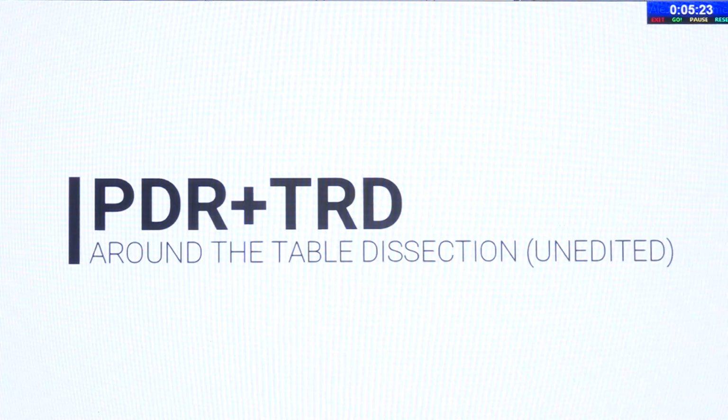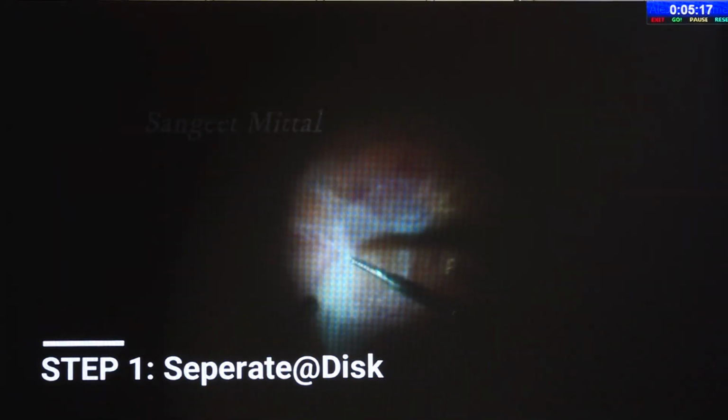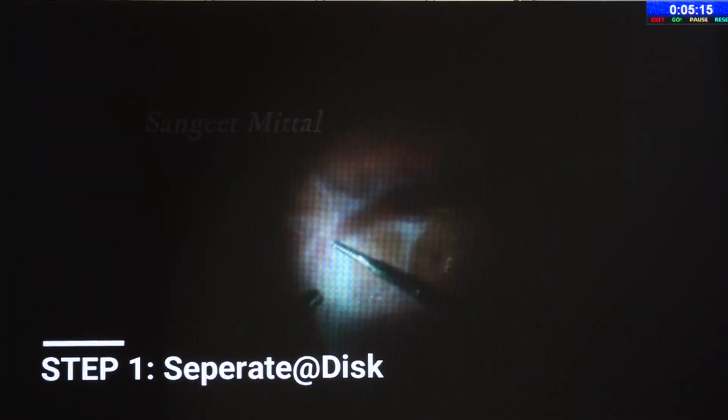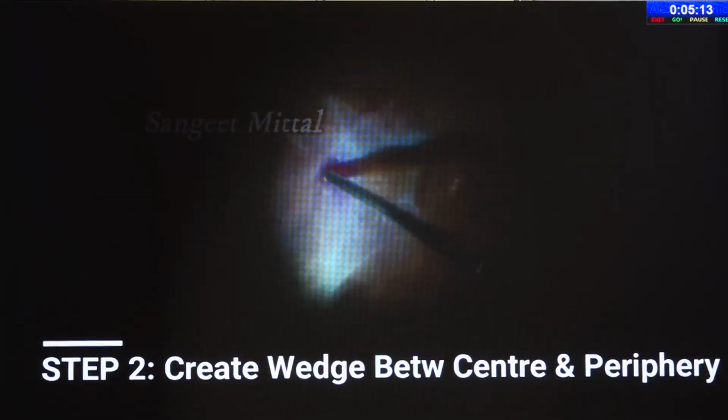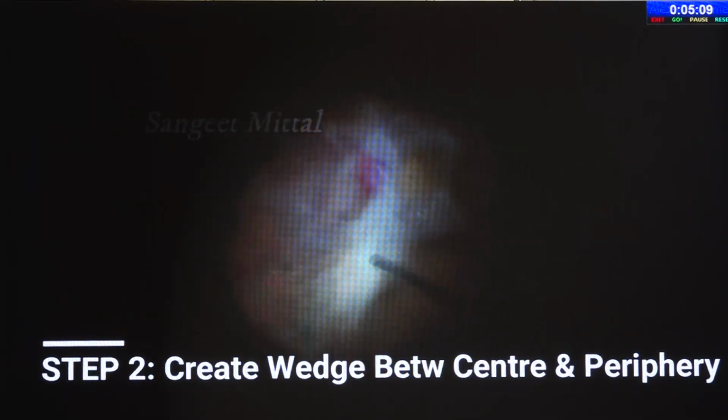So this is a small video. The membrane dissection part is totally unedited, and the patient had a lot of this membrane. I've not cut anything, only the speed is a little faster, two times, in the interest of time. You just see I've separated the membrane from the disc.